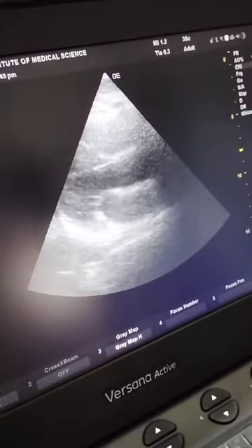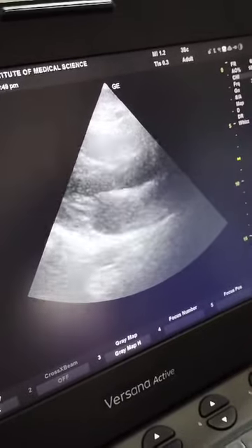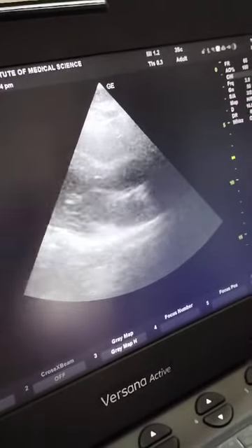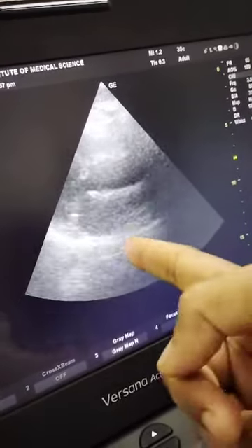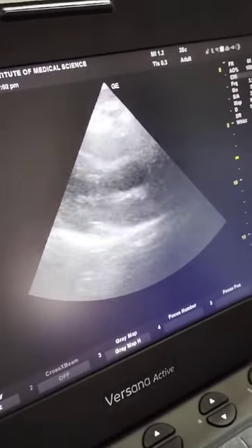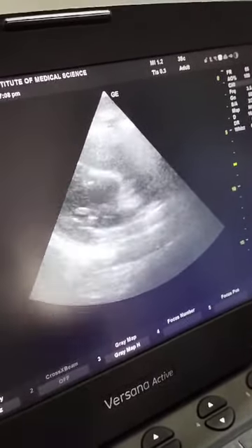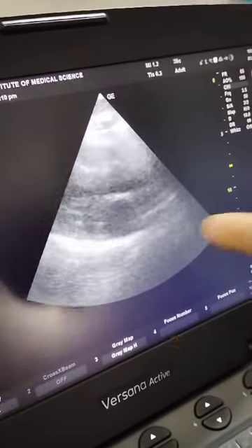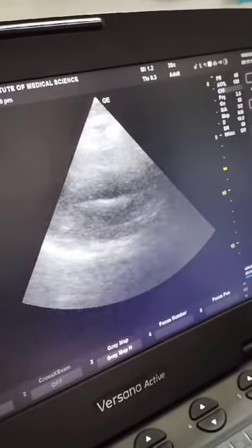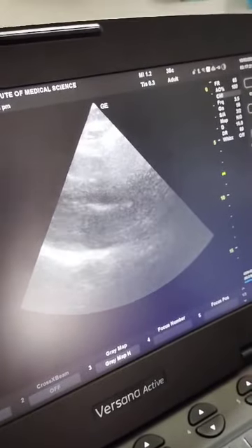Okay, we'll have to work on this further. That will be part of your thesis, where you look into how this can be a good tool. First thing we will have to do is review the literature around this as to mitral annular anterior displacement as a marker for left ventricular diastolic dysfunction. There are many markers of diastolic dysfunction, none of them have been proven to be good enough, and whether just a quick eyeballing of this can give us a good idea is what you'll have to see. So if you keep on doing it for every patient, you'll be able to become adept, and more practically you can pick it up very quickly.